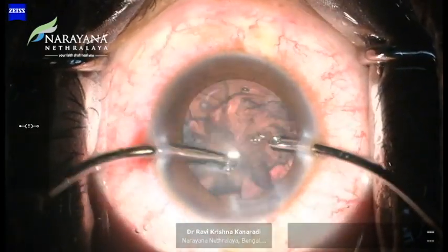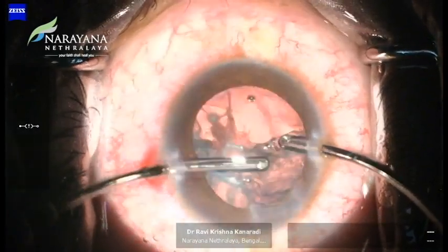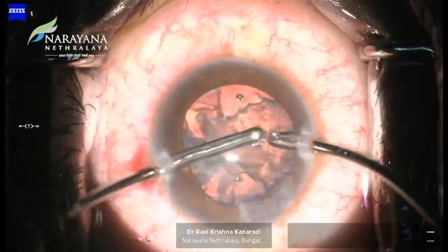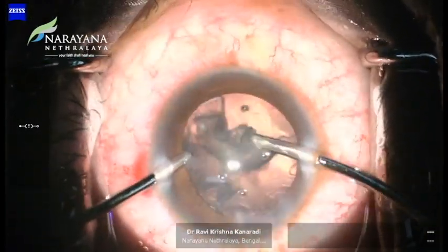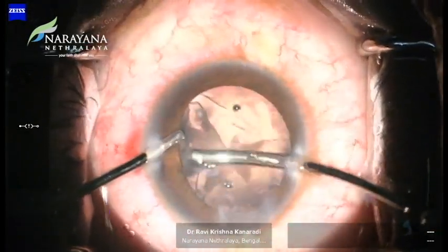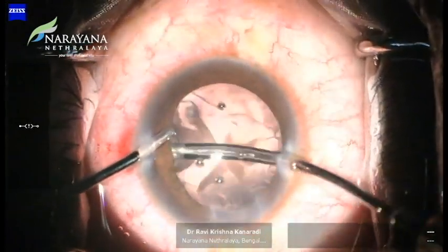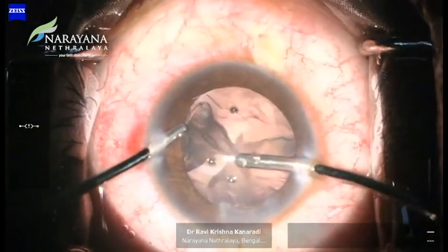Bi-manual irrigation and aspiration is done to remove the cortical matter. An all-out effort should be made to minimize anterior chamber fluctuations at this point. While switching hands, the knee-jerk reflex to withdraw the I/A tip from the eye should be avoided. Rather, the surgeon should stay put in irrigation and the AC should be filled with an ocular viscoelastic device from the side port.